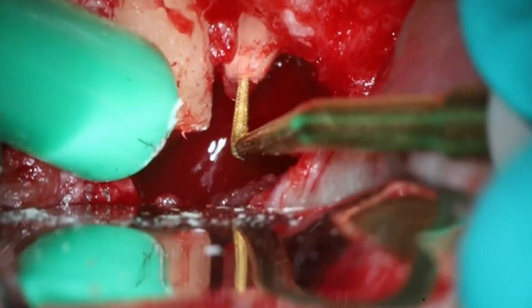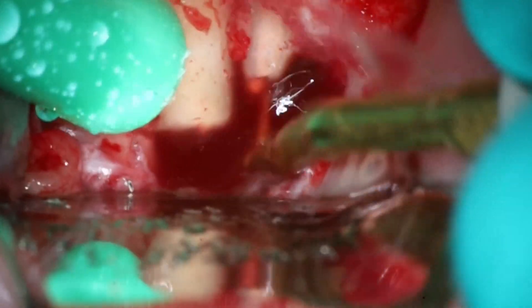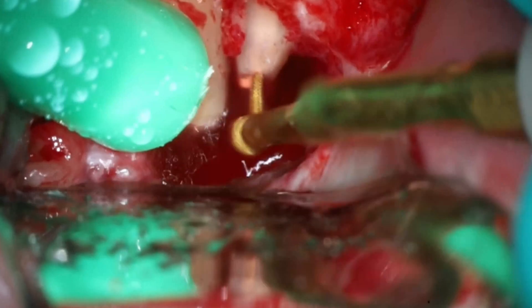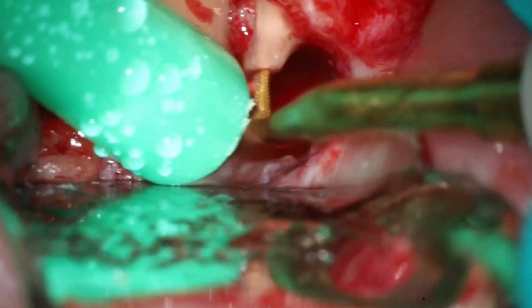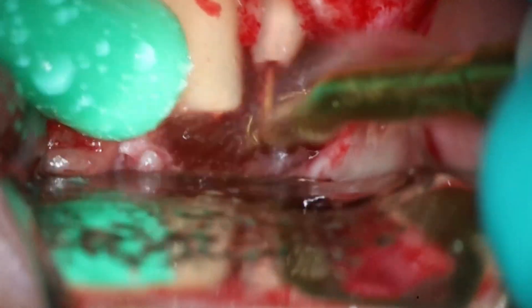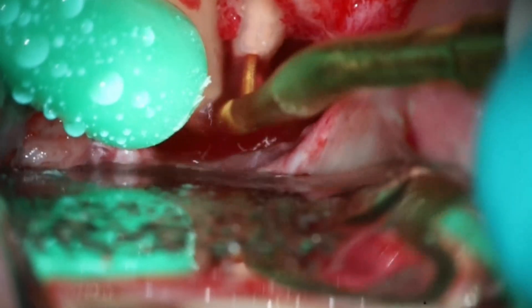I tried to use the longer tip but unfortunately had to go with a shorter one. Simone Friedman talked about this about ten years ago in my residency class — how it is beneficial to remove more in your retro prep if possible. But in this case I didn't want to remove anymore; we were close enough to her nose as it was. So no need to remove more bone. Go ahead and just use my B&L tips — same ones you've seen in the past — and do that three-millimeter retro prep.